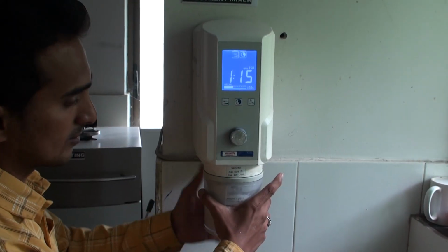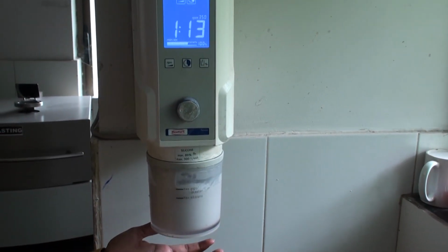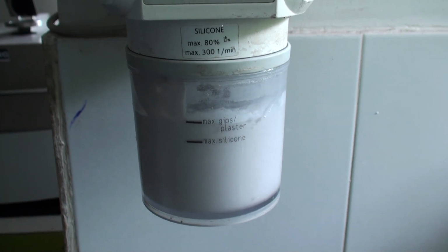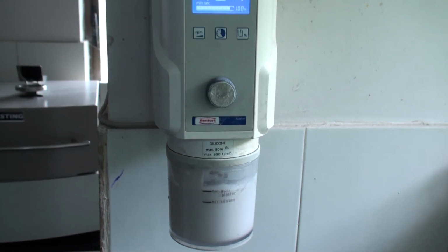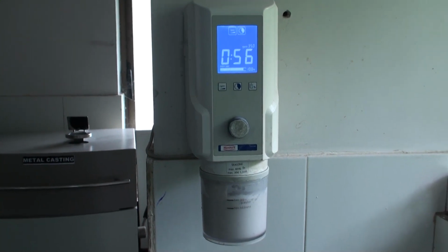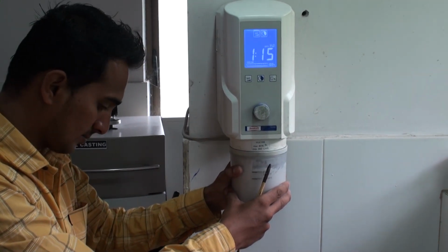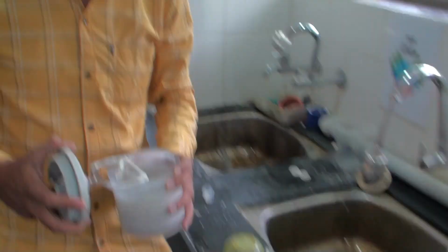Gives it a bit of a hand mix just to get it going. And this is the machine that actually mixes the investment material. It gets put in there. I think it's got a vacuum pump in it, so the air goes out of it and the investment material is getting mixed in this machine. So it gives you a bubble-free mixture. There we go, that's all done and mixed.